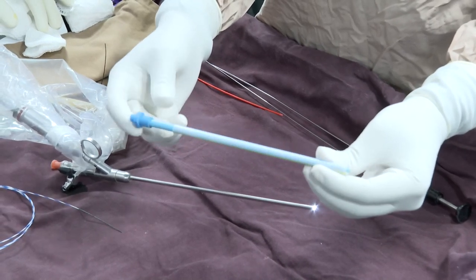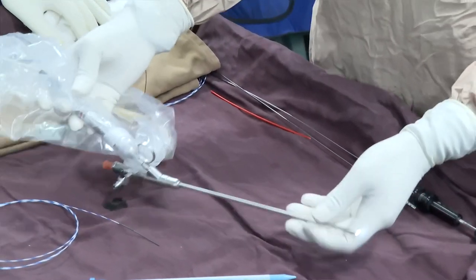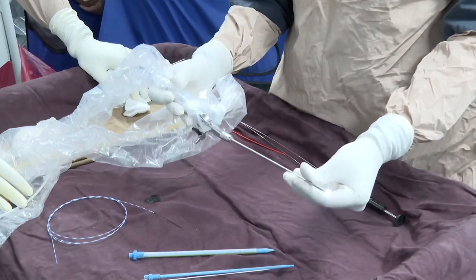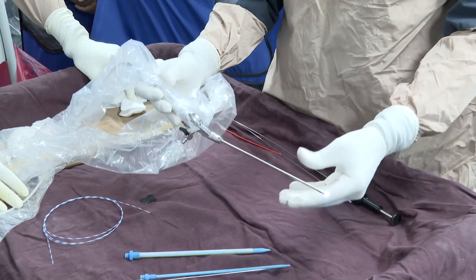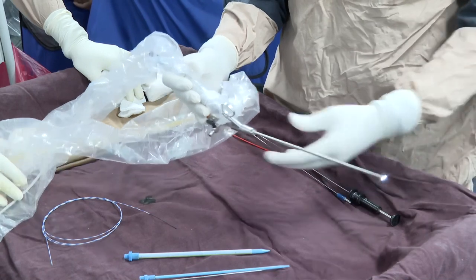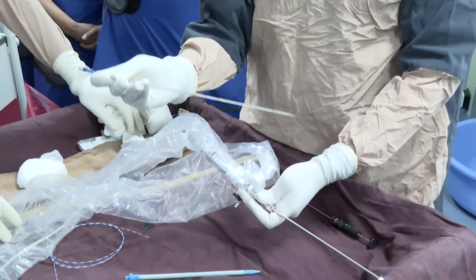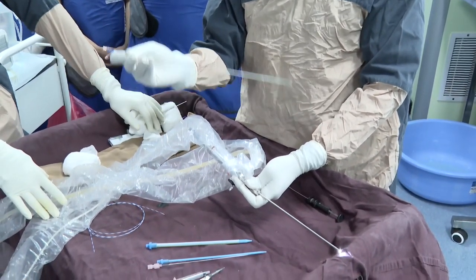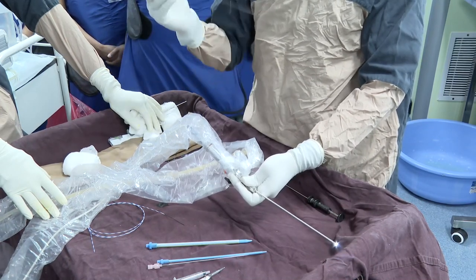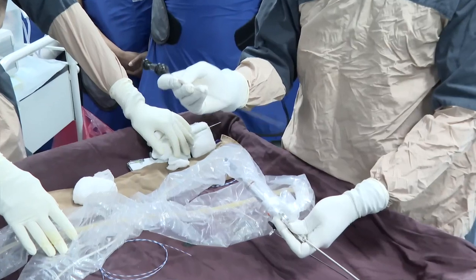Usually I prefer to dilate up to 18 French, but in this meeting I would like to demonstrate how this sheet works. This is a 12 French mini nephroscope — it's a chip-on-tip digital scope. I find it very handy and it has a working channel of 6.5 French where I can use a 1.4 mm pneumatic lithoclast.